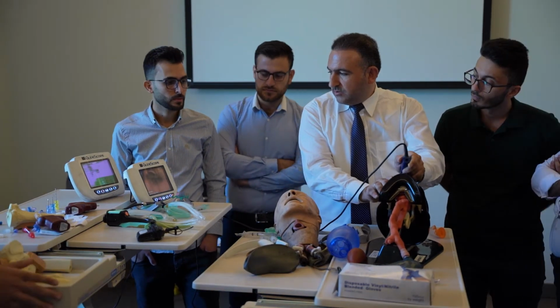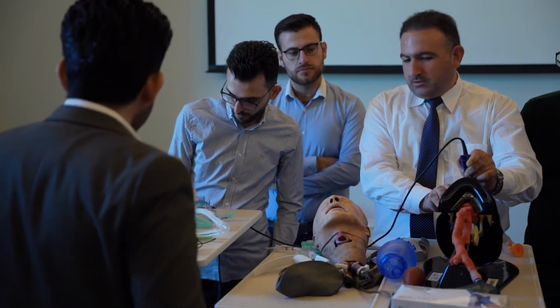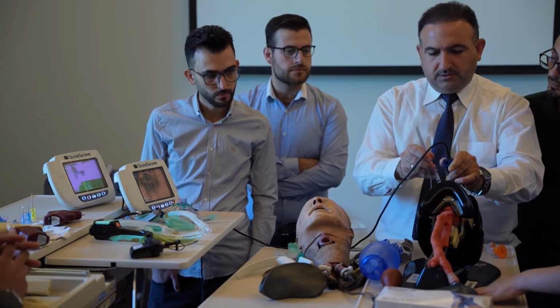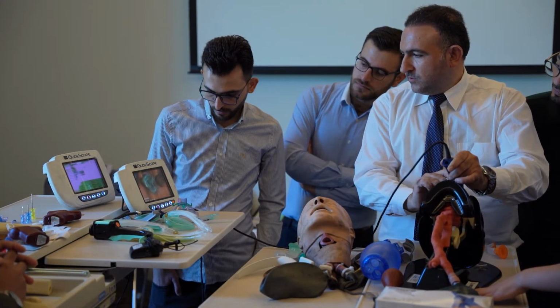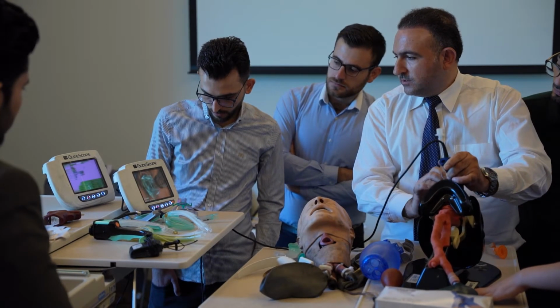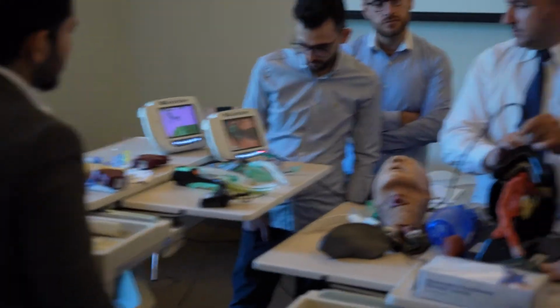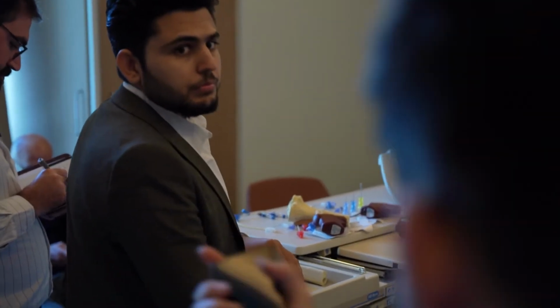I see the epiglottis in front of me now. I see the vocal cords now. You can simply move it. Then apply lubricant. Put it where? In the vocal cords, between the vocal cords.